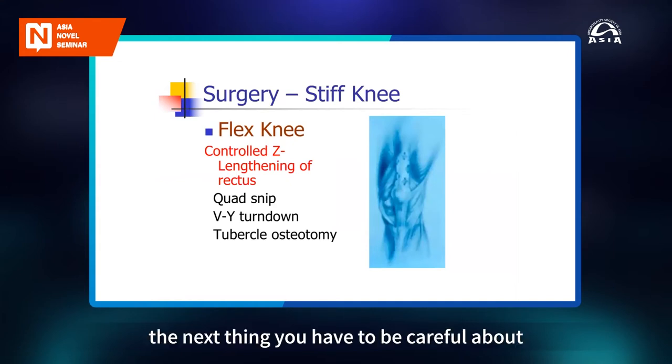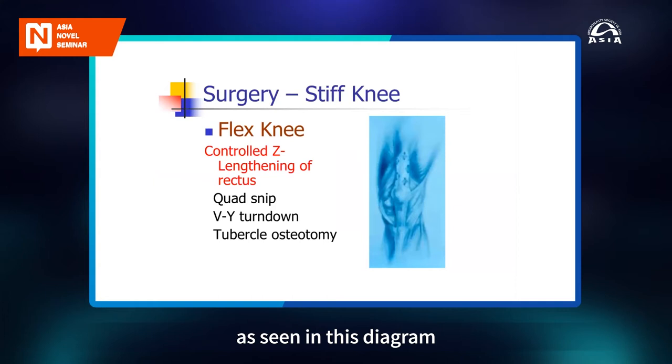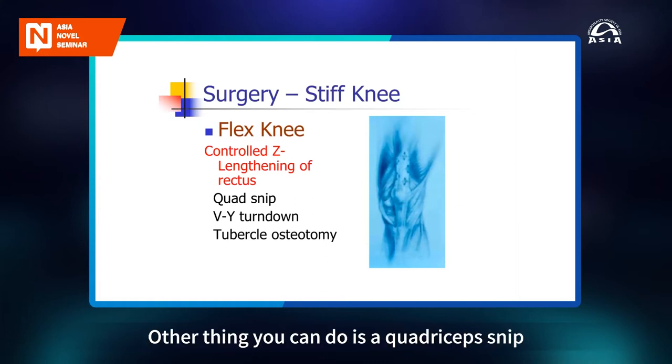After you've done that, the next thing you have to be careful about is you have to get the flexion back. To get the flexion back, the ideal thing to do is to use the small Z lengthenings in the rectus as seen in this diagram. It was very difficult to take pictures of this on the table because this is so small, it doesn't show nicely. So a diagram shows that you make small Z lengthenings in the rectus or the quadriceps, central part of the quadriceps. Other thing you can do is a quadriceps snip.